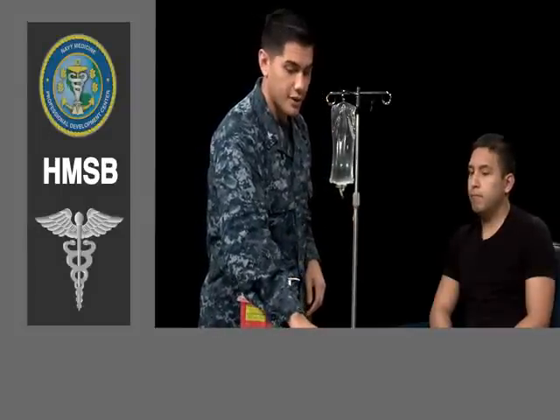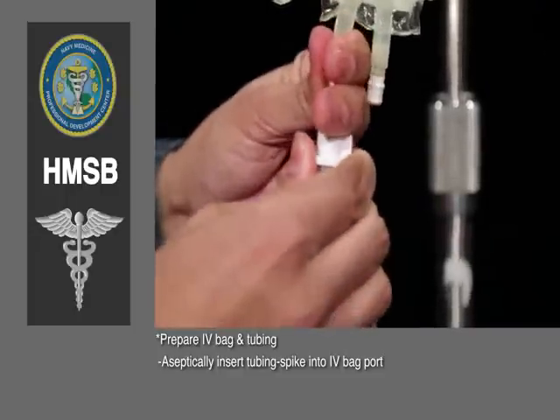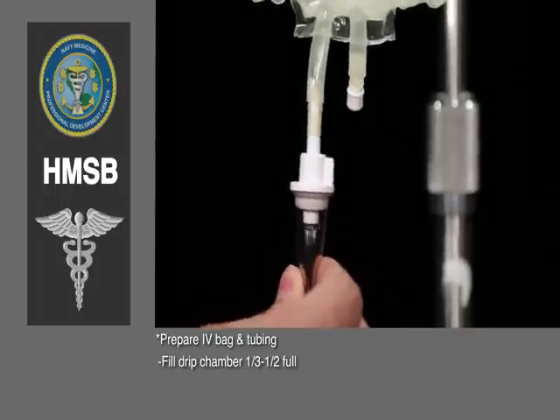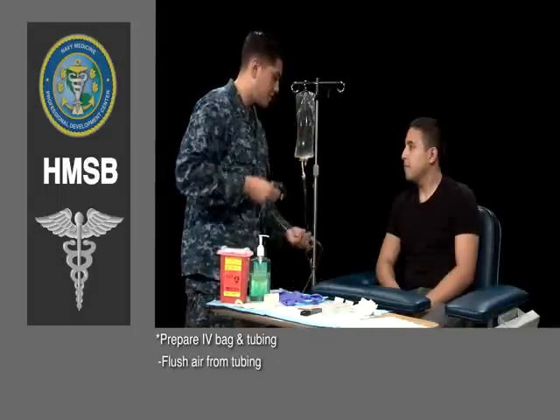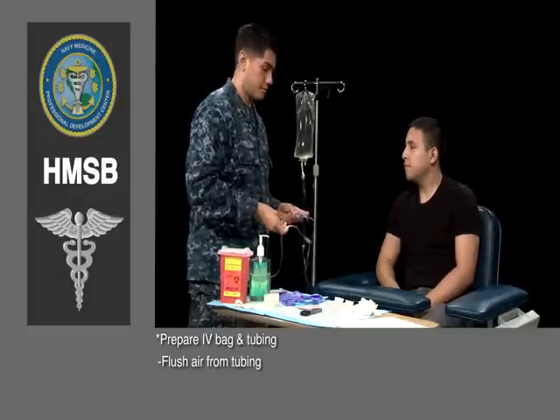Next, I'm going to aseptically insert the tubing spike into the IV bag. I'm going to fill the drip chamber so that it is 1/3 to 1/2 full. After that, I'm going to release the roller clamp to flush the air from the tubing.